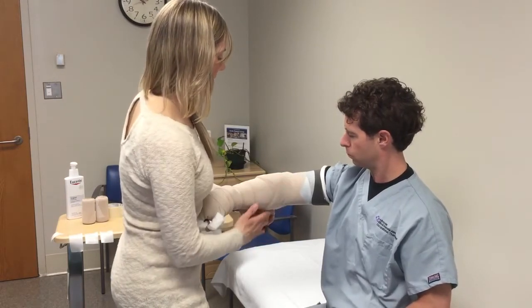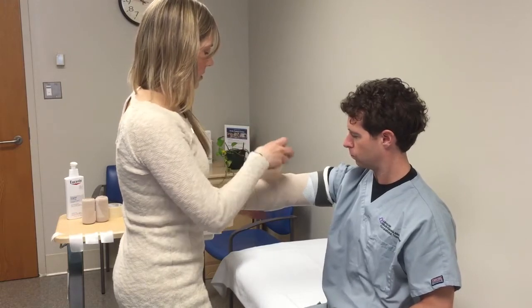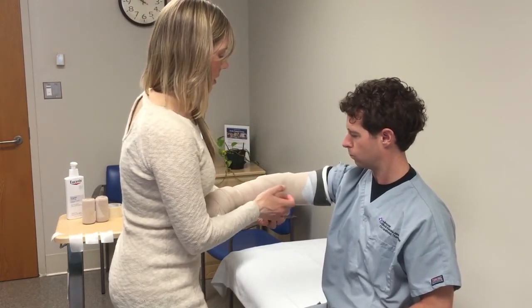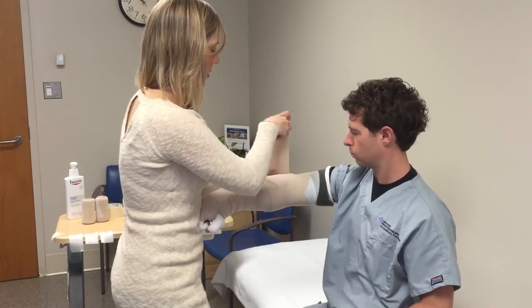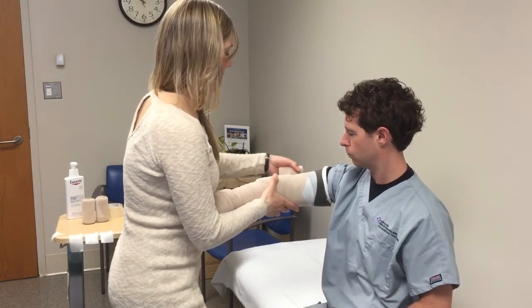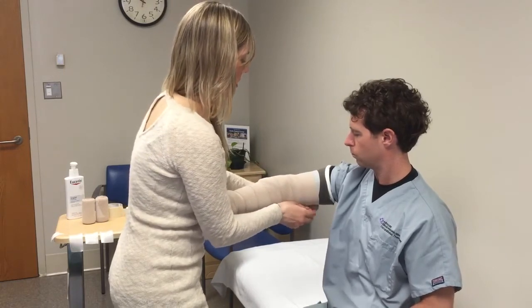Make sure it's smooth and flat but not too tight, and then continue spiraling up the arm. The patient can keep their arm in a slight bend to ensure you didn't wrap this too tightly. Then continue up the arm.